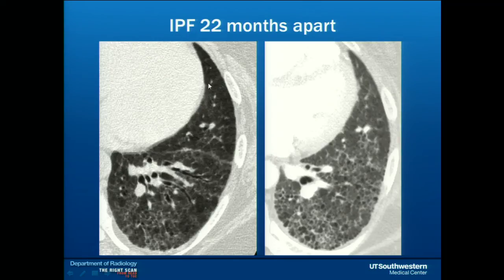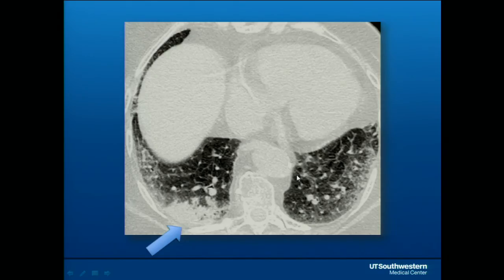This slide shows how fast the progression of fibrosis has occurred in this patient. You can see traction bronchiectasis and reticulations, and over a period of 22 months the honeycombing, bronchiectasis, and fibrosis had progressed. These patients are also more prone to get malignancies, and serial high-resolution chest CTs can help detect bronchogenic cancers in these patients.